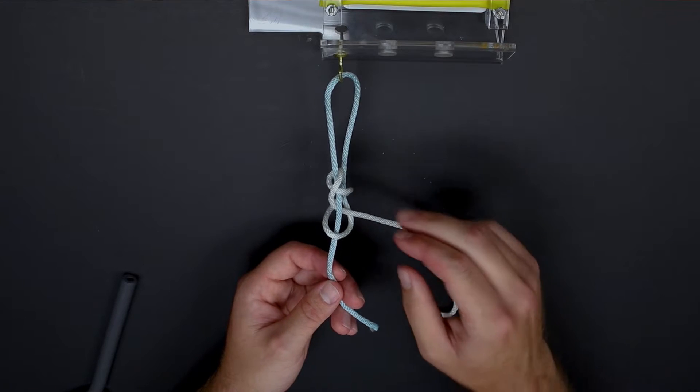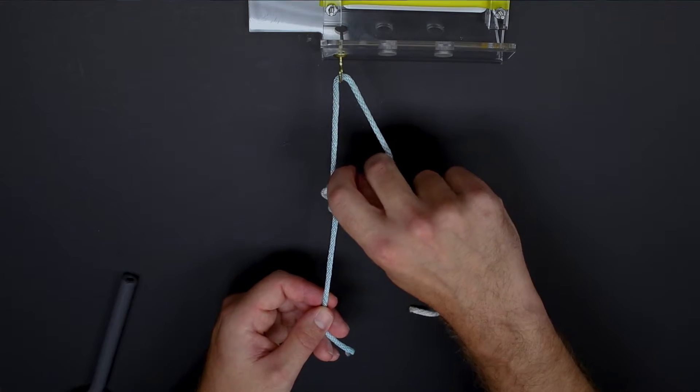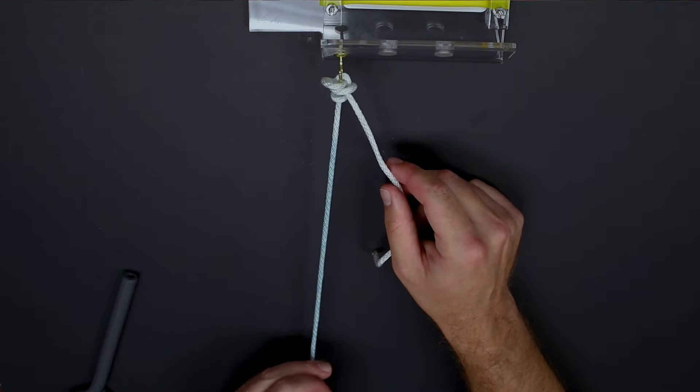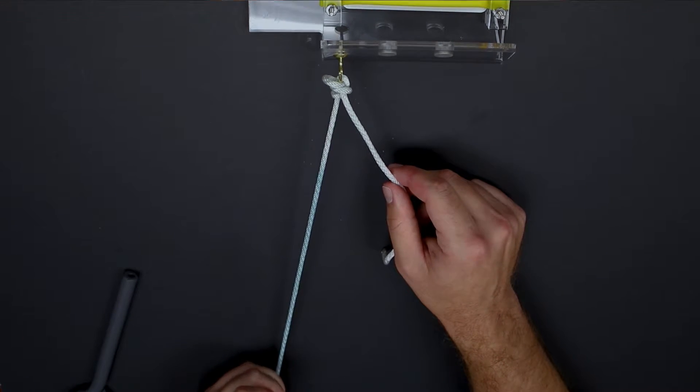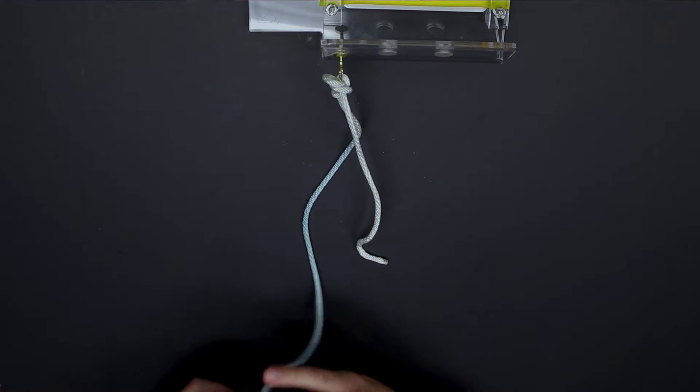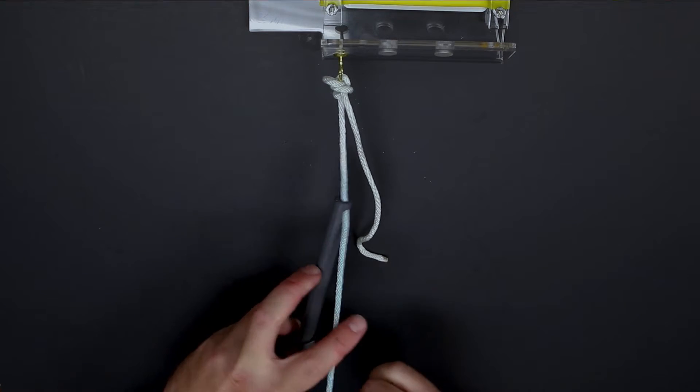You do not want to pull on this loop limb as this will lock this type of knot. We can dress the knot before we place it through the cannula and then we pull on the post limb in order to secure it against the tissue. A knot pusher may then be used in order to further push this against the tissue.